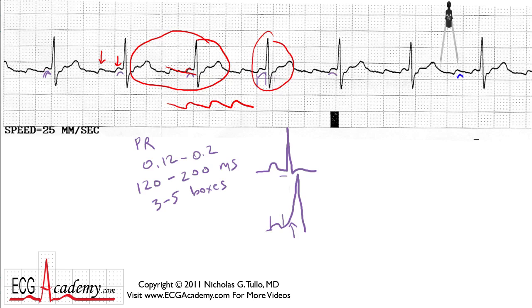When thinking about flutter waves, we're seeing one, we're seeing two, then there's one buried in the beginning of the T wave, and there's one buried at the end of the T wave. So you have to consider this four flutter waves for every QRS complex, and it just keeps repeating over and over again. You could call this atrial flutter with four-to-one conduction.